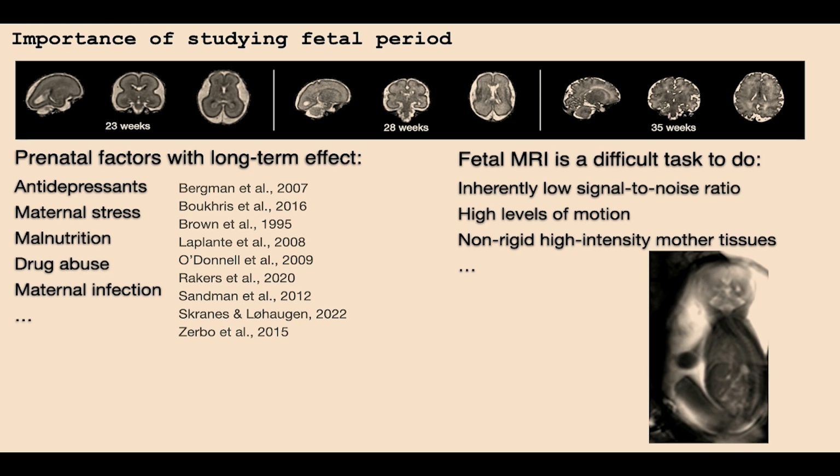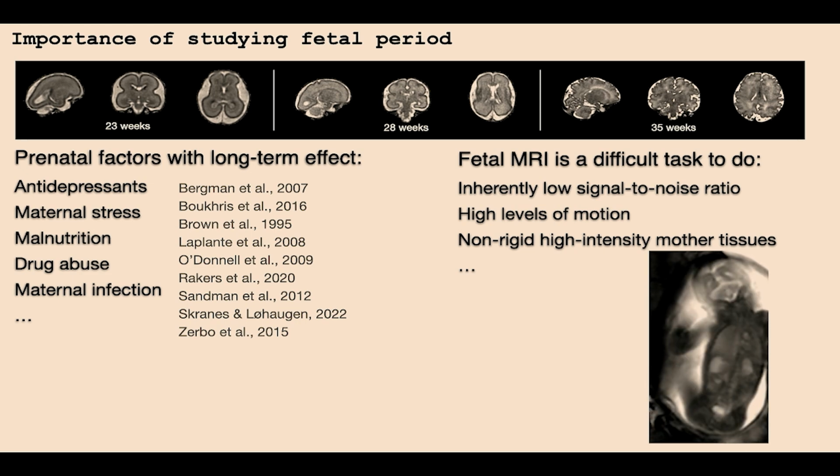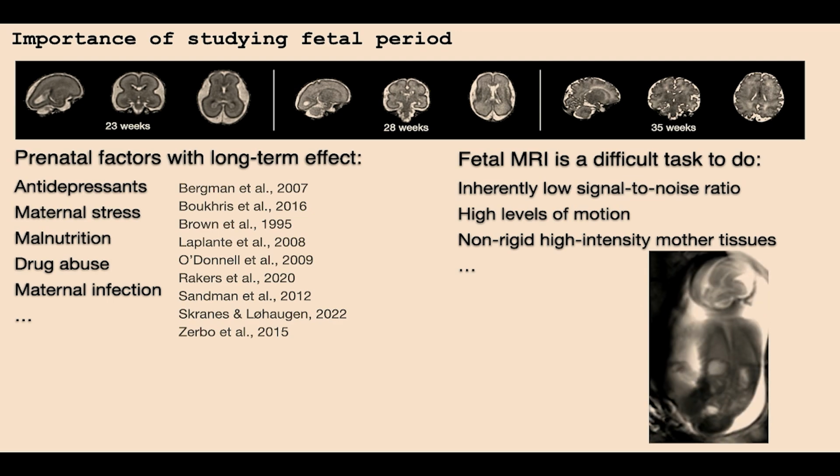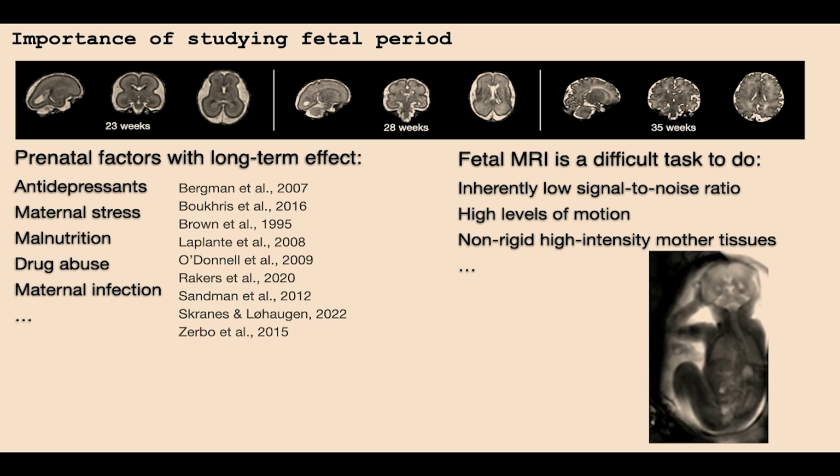It's inherently low signal-to-noise ratio data. It has a very high level of motion. Non-rigid high-intensity maternal tissue also interferes with acquisition and preprocessing of the data, and there are many other factors.